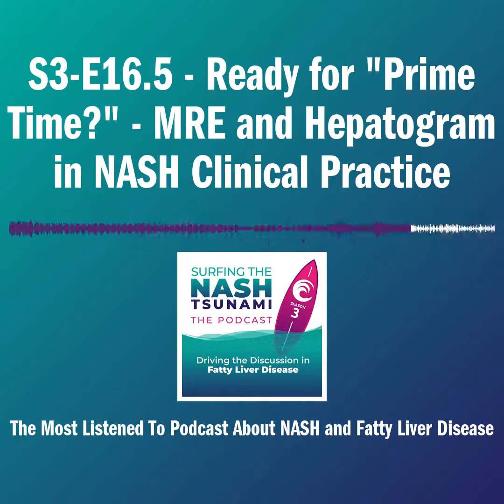I couldn't agree more with Kay. I love the utilization of both PDFF and MR Elastography in my clinical practice. I don't always use it as a first line. I get FibroScans and clinical labs in all of my patients. And remember that with 100 million Americans with fatty liver, about 75 to 80 will grow old with their fatty liver.